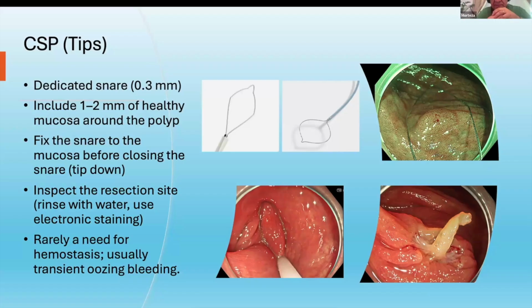But sometimes, there's something I don't recommend, where you do a cold avulsion, where you just pull at it. I don't like that, because done violently, it may actually give you a big problem. And the other issue that may happen is that you may get quite significant punched out submucosa. I think you have something like that in the third picture you have down there that you're sharing. You have that punched out submucosa just looking right at you.